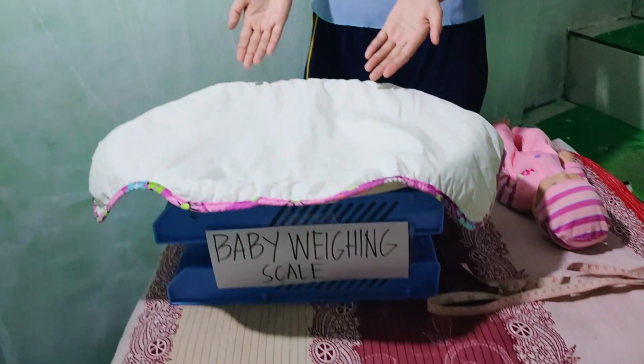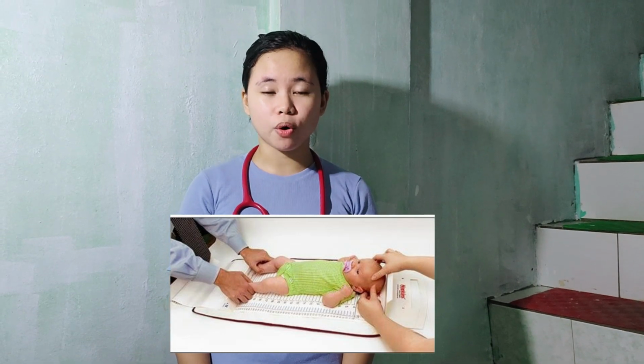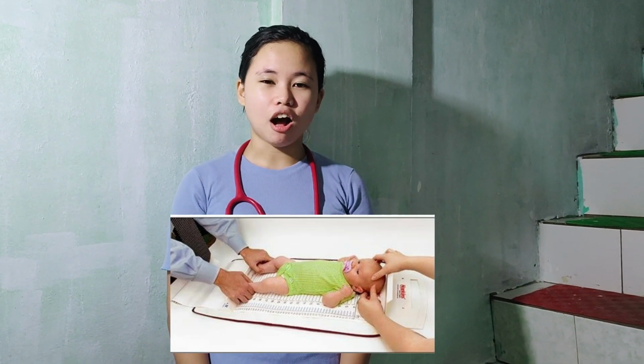I will demonstrate how to measure anthropometric measurements of a newborn baby or child's physical development. We need the following: baby weighing scale and tape measure. We also use an infantometer for measuring the height of the baby. In measuring anthropometric measurements, we need to measure first the head circumference of the baby, second, the abdominal circumference, third, the chest circumference, fourth, the weight of the baby, and last, the height of the baby.